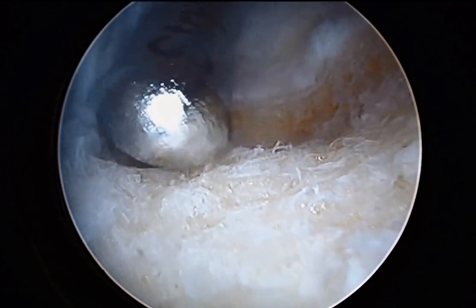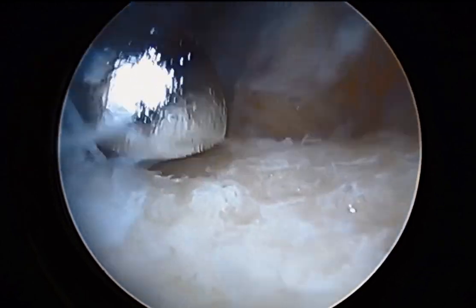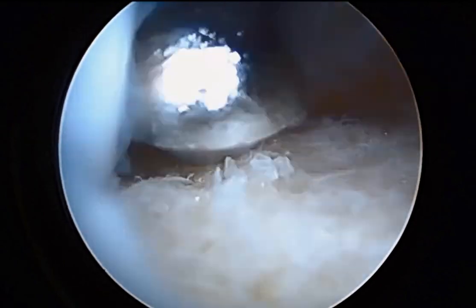During this video, we are using a burr to resect the prominent bone, and the Achilles tendon can be seen to the left of the video.